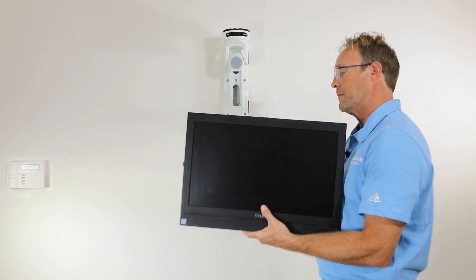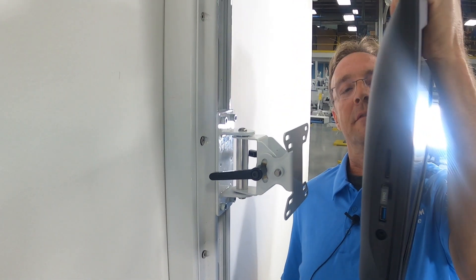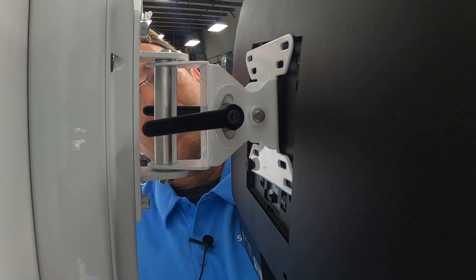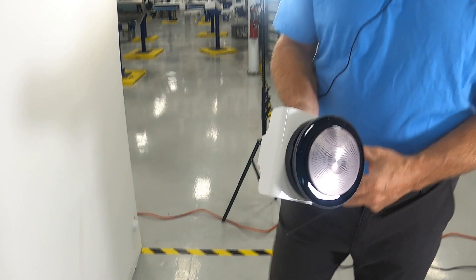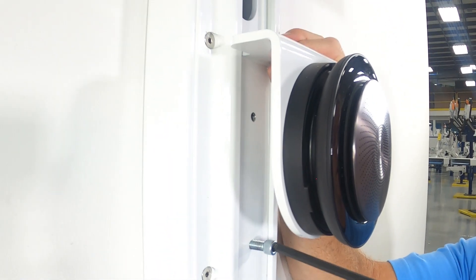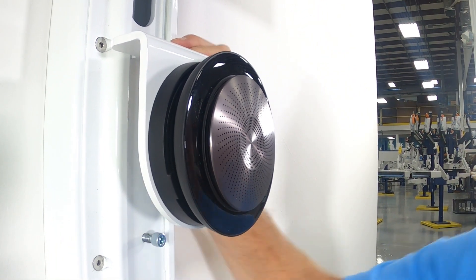Now we're going to install the all-in-one computer — they're a bit heavy so you've got to be a little careful. And now we are going to install the speaker bracket. I might install the speaker under the bracket first for a simpler installation. Set it at the desired elevation and screw it down.